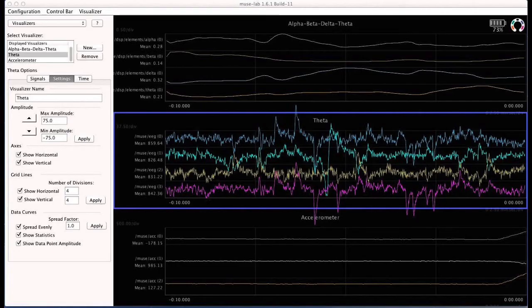Although the Muse headset is consumer friendly for learning how to meditate, we had difficulty utilizing it due to the company stopping support for its SDK and several Muse related apps, such as the Tesla Muse Android app being taken off app stores. Although Muse EEG data can be streamed via OSC, many Muse friendly OSC receivers, such as Muse Lab, were no longer available for use.